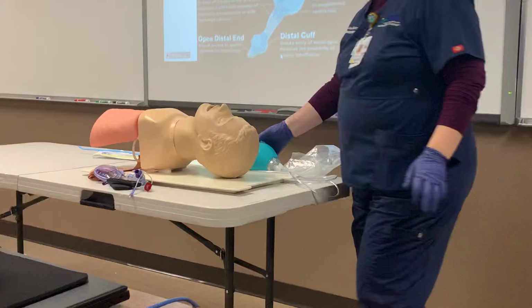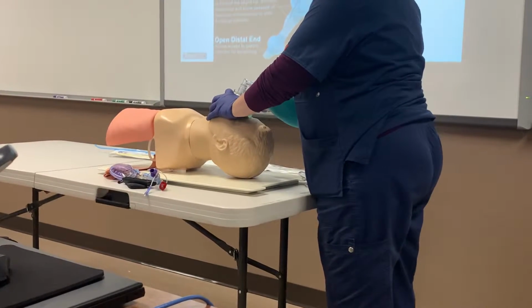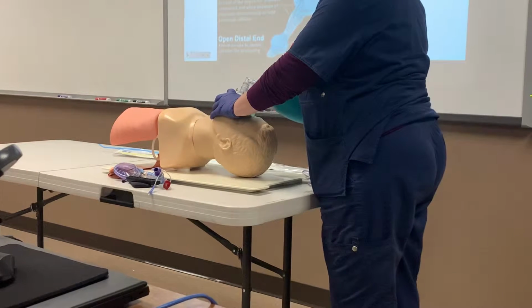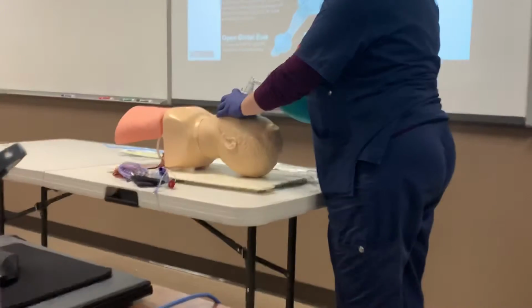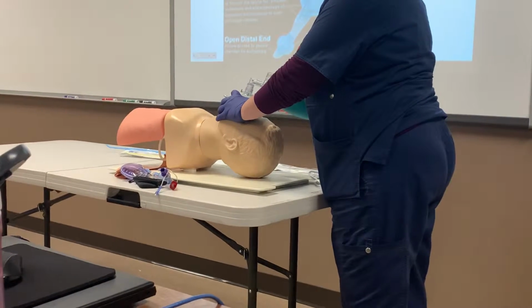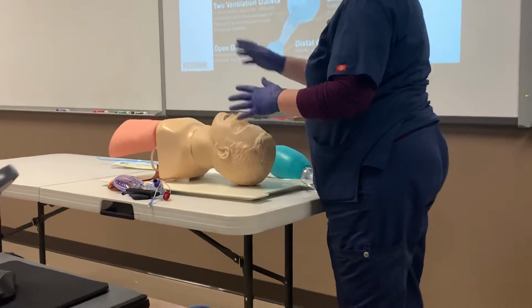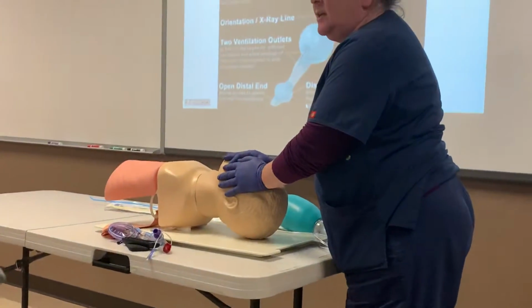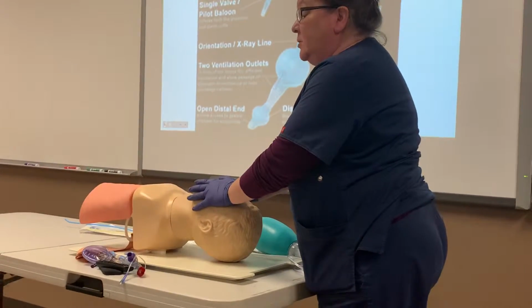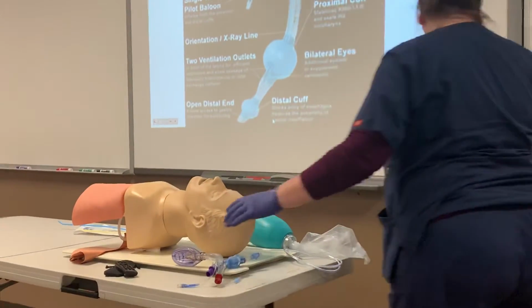So if I come over here, patient's found down, and I cannot ventilate them right now without even trying to intubate, then we already know we're going to have a difficult airway. Otherwise, we can do this, and we're not able to get them intubated after 3 attempts or 10 minutes. Does that make sense to everybody? Okay. So what are we going to do? So we've already determined we cannot get this patient intubated and or we cannot ventilate and oxygenate. So we're going to try to insert a supraglottic airway device.